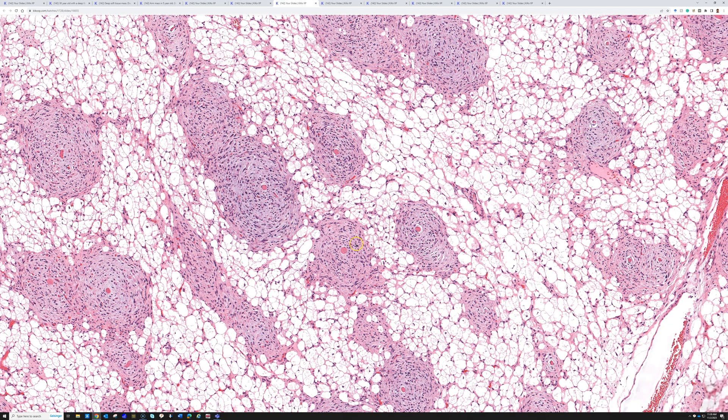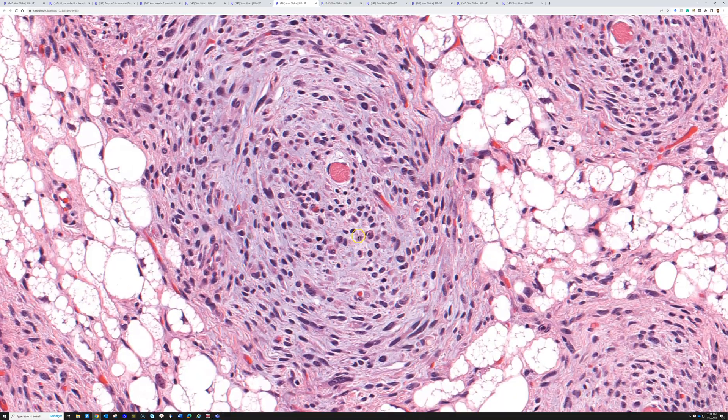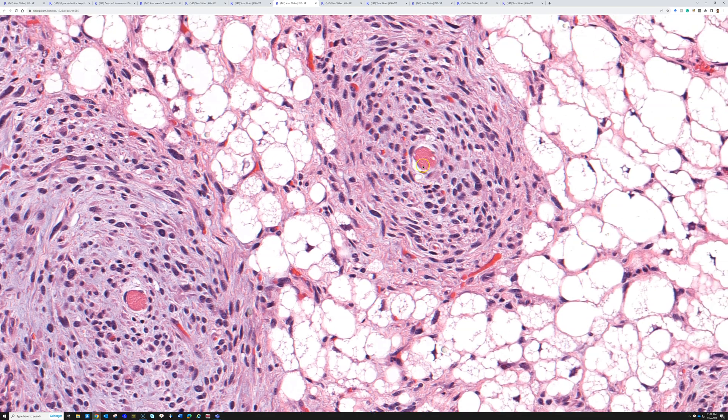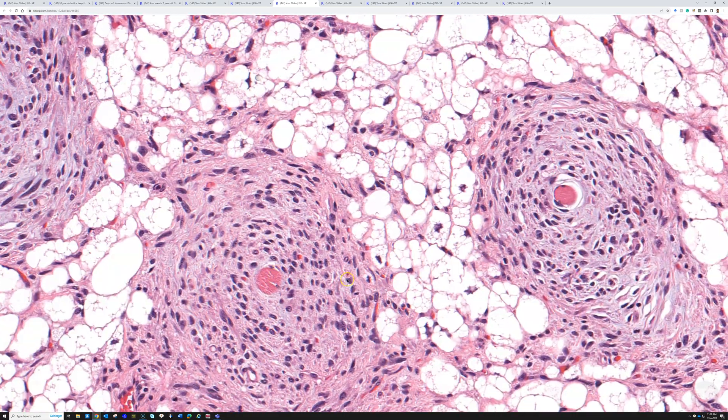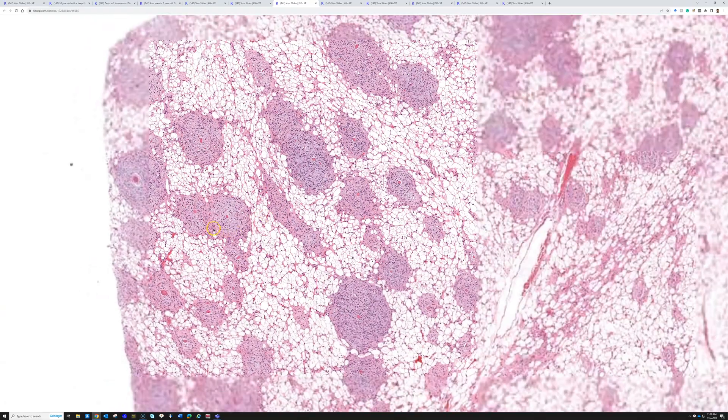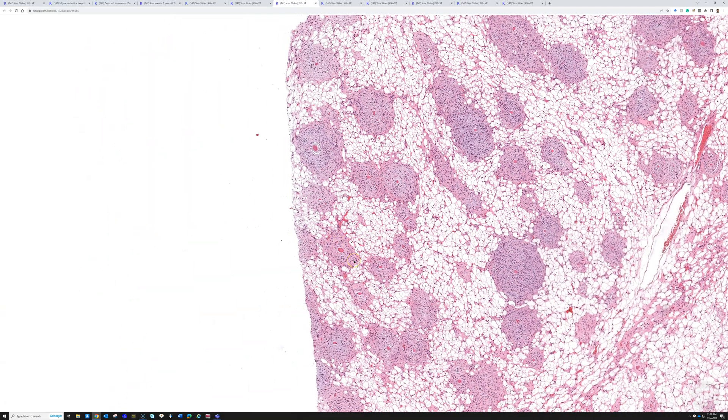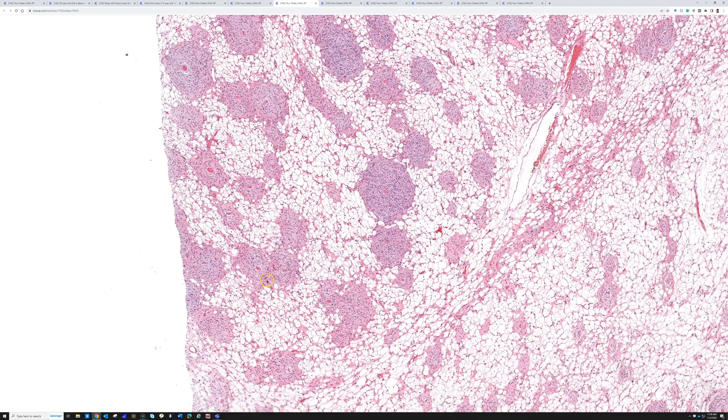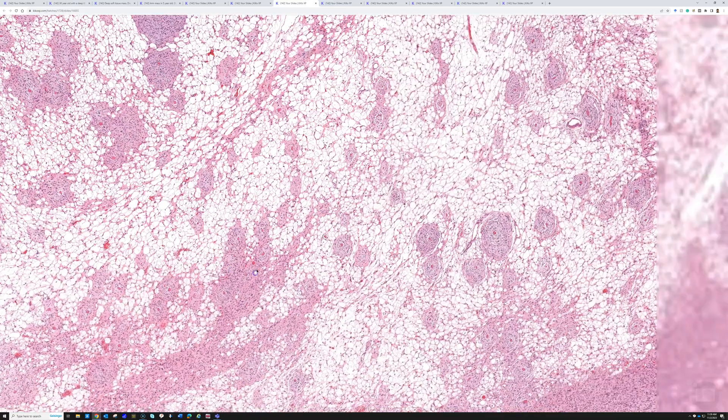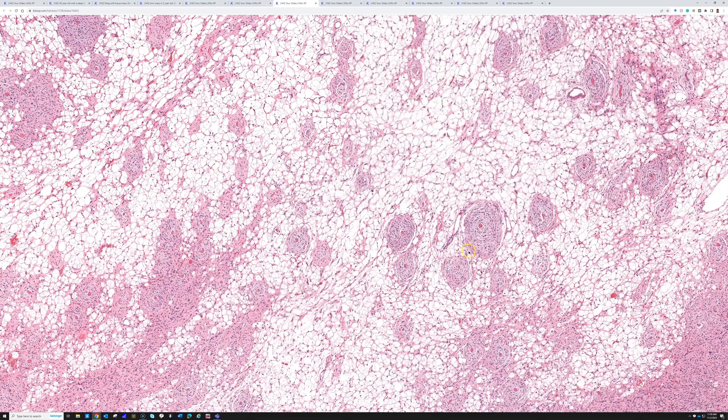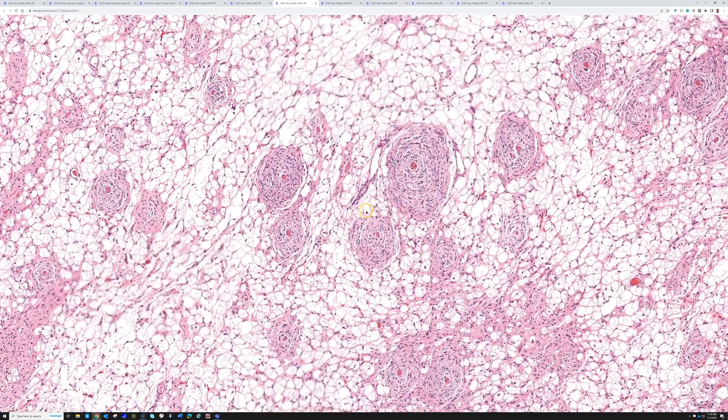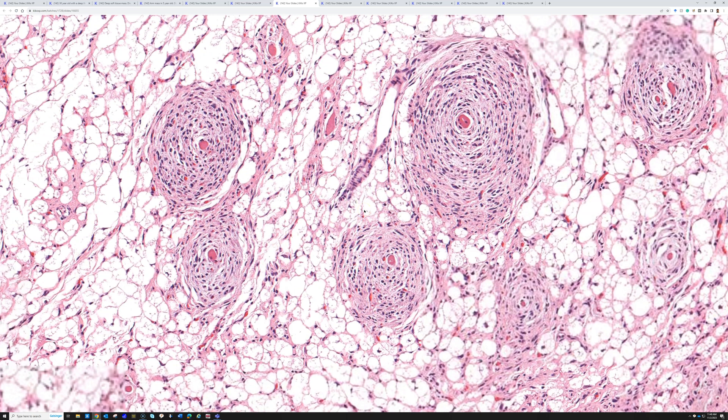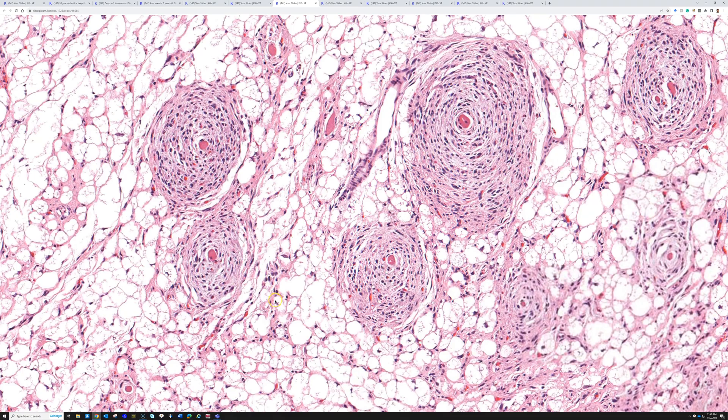Also, look what's in the middle of these meningothelial whirls. Each whirl has a little fiber of skeletal muscle in the middle of it, and I cannot really explain why that's happening. I'm not sure if it's because the tumor infiltrated skeletal muscle and then swirled around each fiber, or if the tumor is differentiating into mature skeletal muscle fibers. I suspect it's from infiltration and then the whirling developed around the fibers. I have never seen this particular pattern in de-differentiated liposarcoma before.